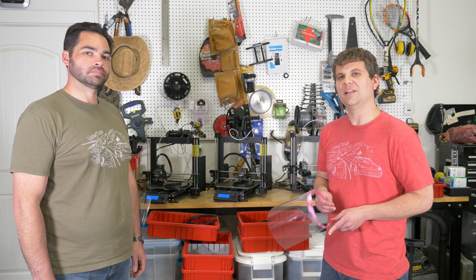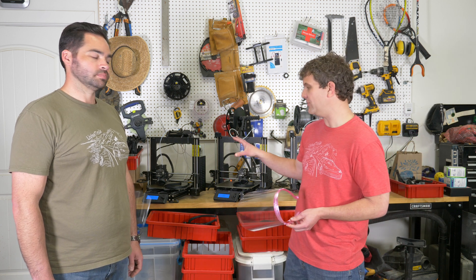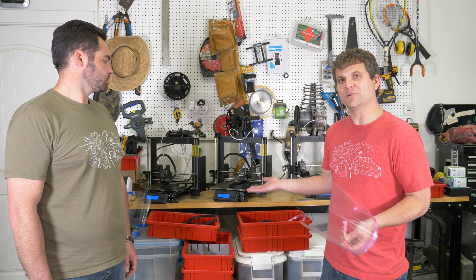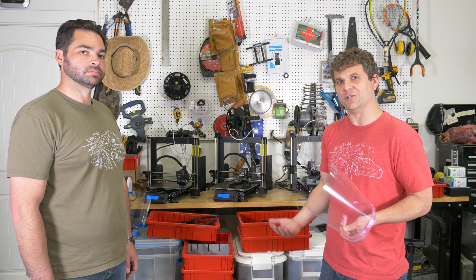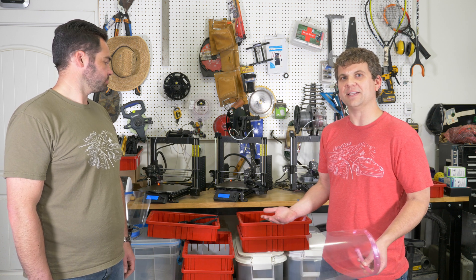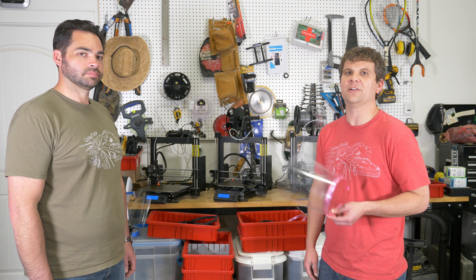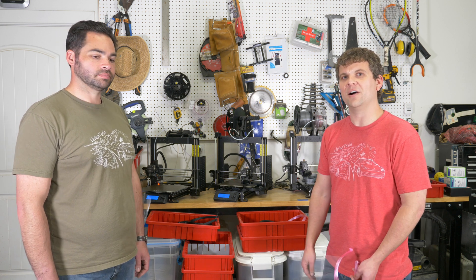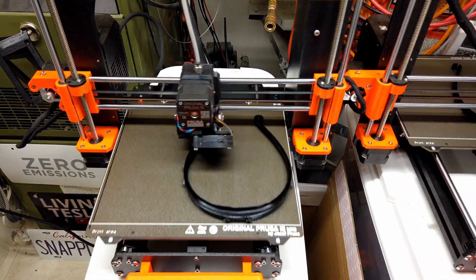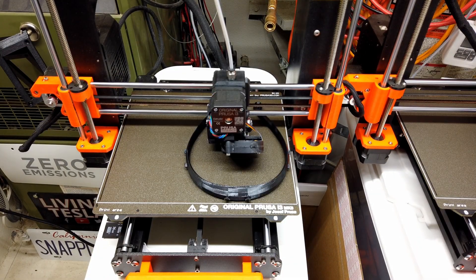We're making this open source — we have the files available on our website, livingtesla.com/COVID-19. The G-code we're running to automatically unload the printer is right now printer-specific, but thankfully we use the most popular printer in the world, so a lot of people's printers can do this directly using our files. We'll also put our files out on GitHub so that anybody can take this and do the same thing with their printer. We're looking to the community to make this available for everybody so we can all increase our production capability. Check out livingtesla.com/COVID-19 for all the details.